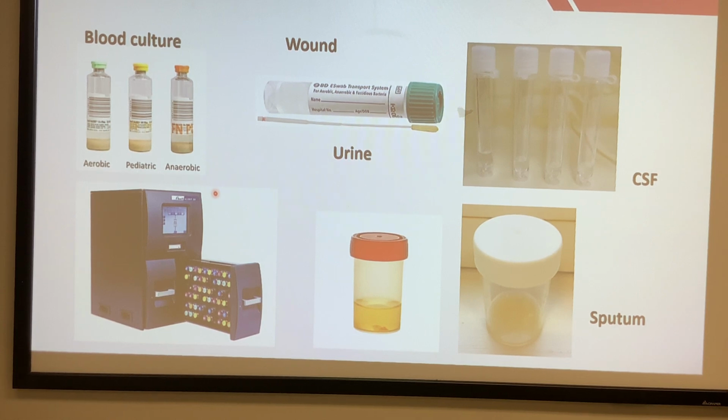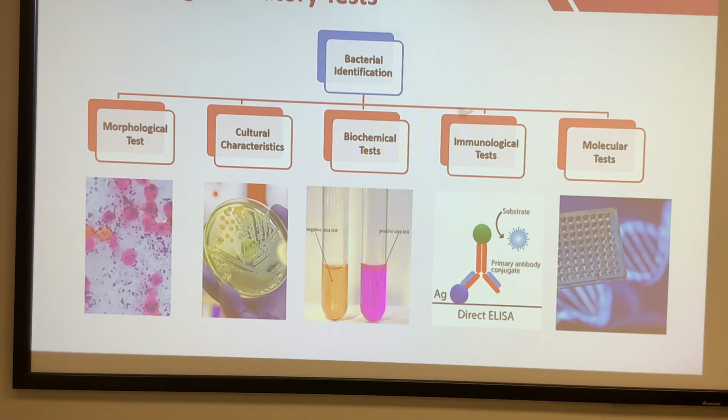All of these have a certain standard process. Depending on where we get a sample, we have different procedures to proceed with. Take bacterial infection as an example. Normally we do morphological tests, which are the staining techniques, direct observation, and then we streak the plates, or depending on what bacteria we're talking about, we might inoculate a broth to make sure they grow, an enrichment. Then we pick a colony and streak other plates to let them show their cultural characteristics, because I'll talk about the media later on, and they show different characteristics on different media. So that's a way to differentiate and identify them as well.